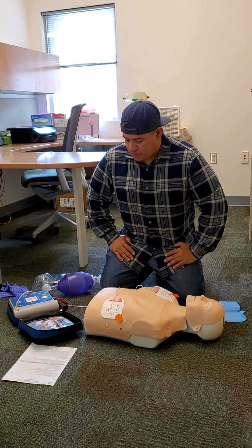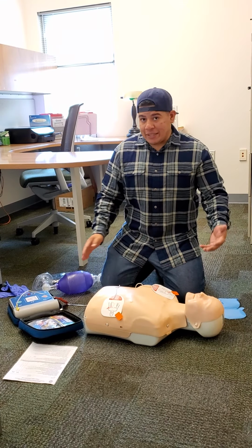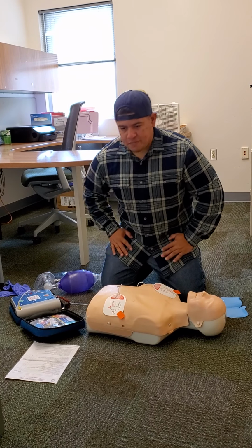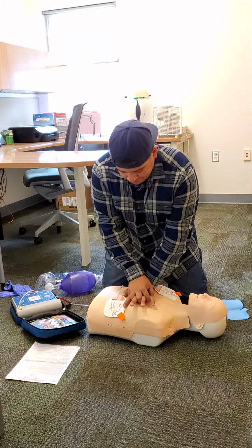Shock advised. Charging. Stay clear of patient. Deliver shock now. Press the orange button now. So you make sure everybody's clear of the patient. So say clear, and then you'll deliver the shock. Shock delivered. Begin CPR. And you'll resume CPR.